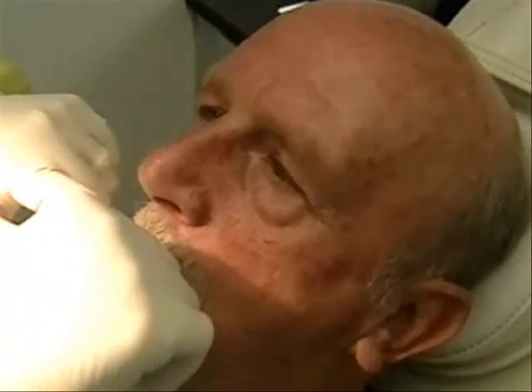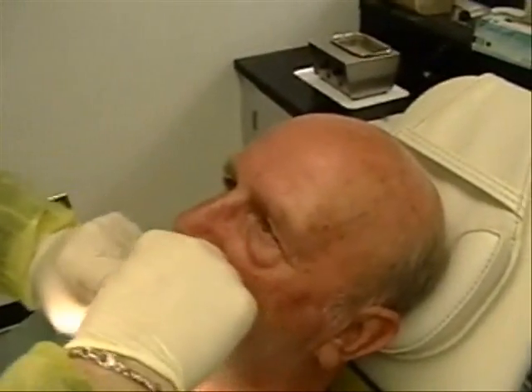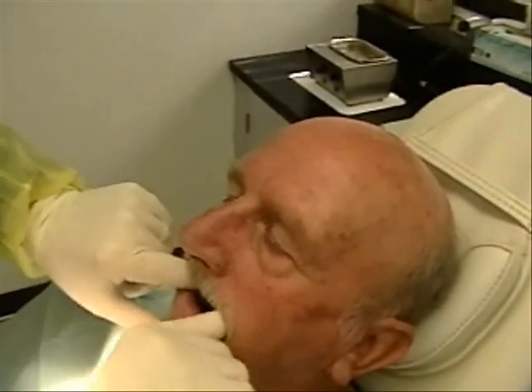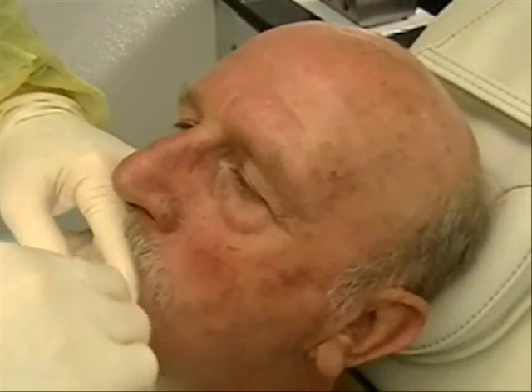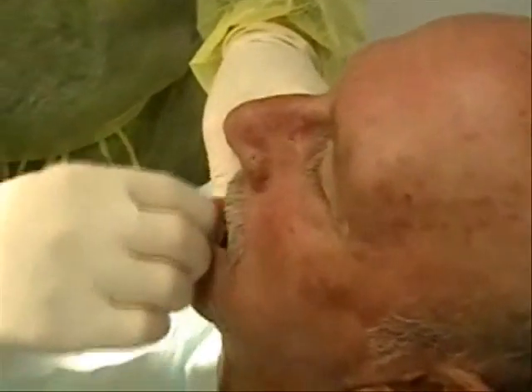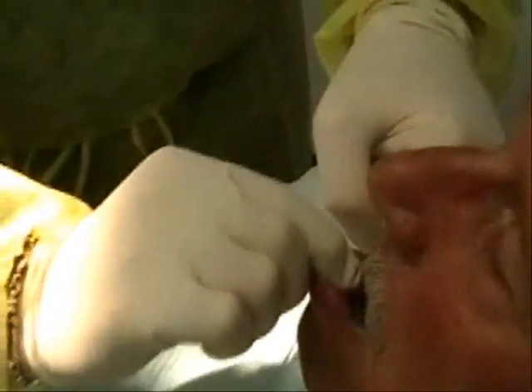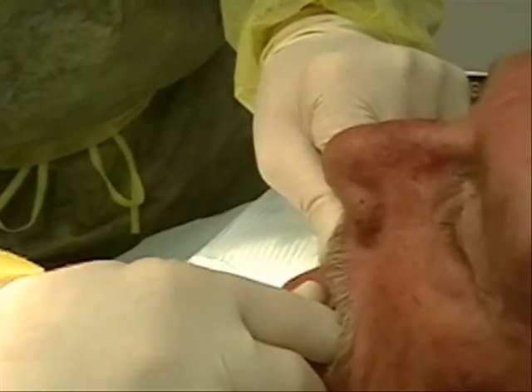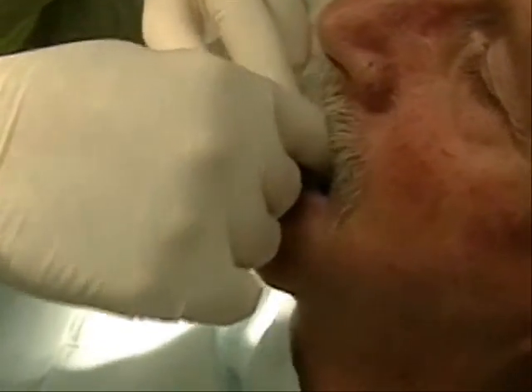It's good stuff. Now what is that made of, do you know? It has waxes in it and everything. Just relax. Make sure it's seated everywhere. And we'll just pull your lip out and up. You're doing a lot better today about relaxing for me. You're doing good. See, it's not moving on us — that's good. We'll take that out now.